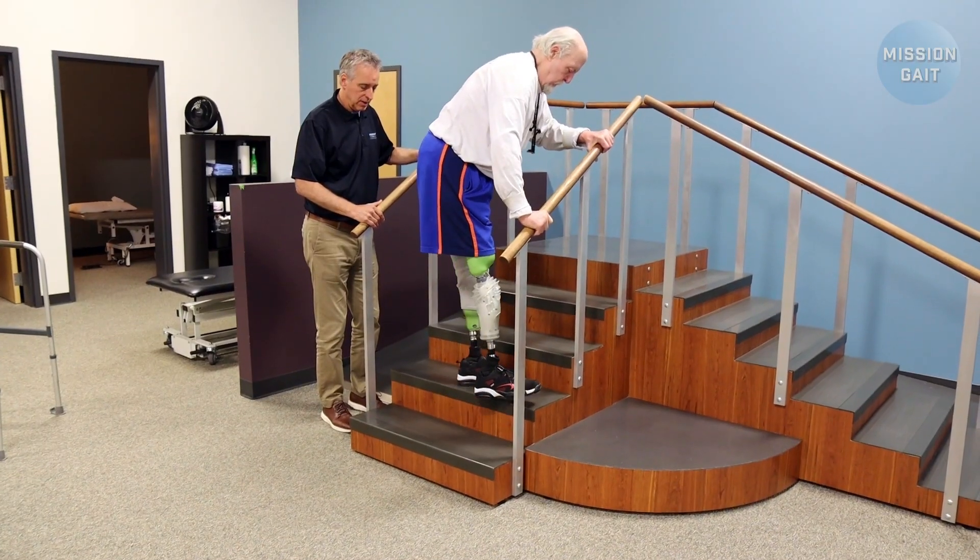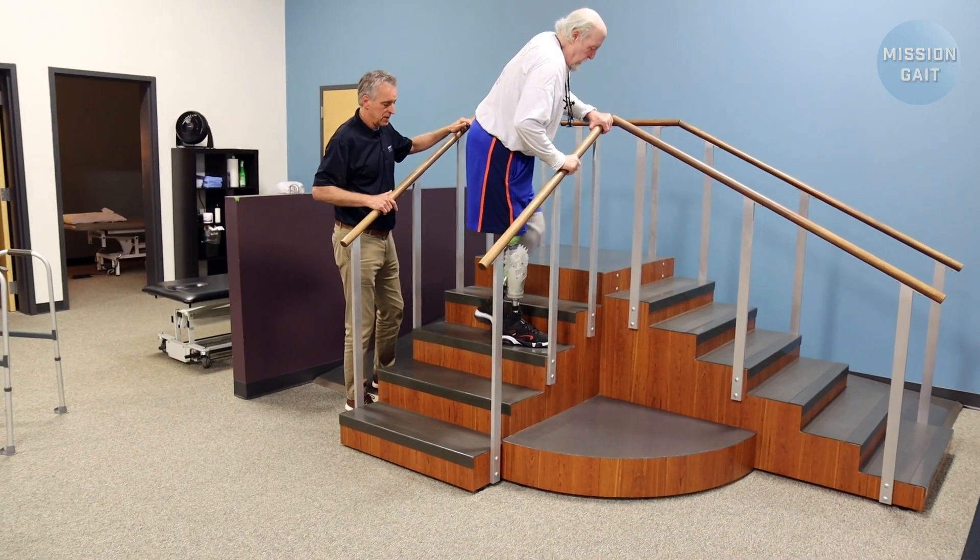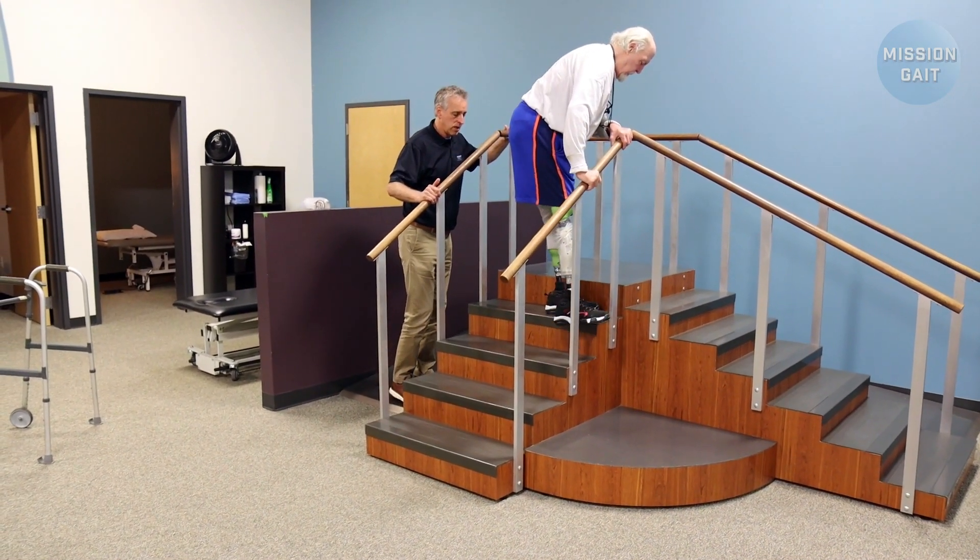Many people at home have stairs and their rails are just too far apart to get a good grip on both sides, so you always want to teach patients how to do it with a single rail only.